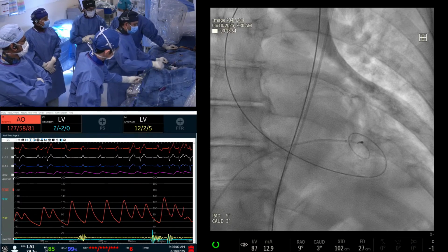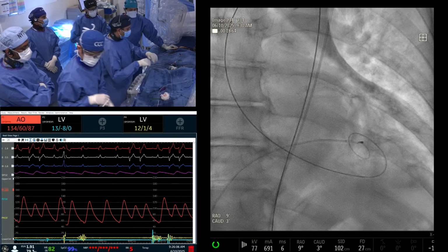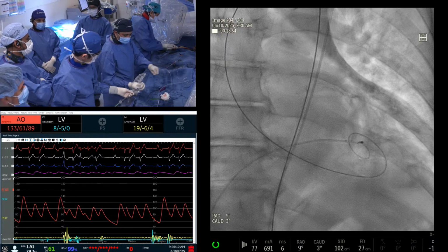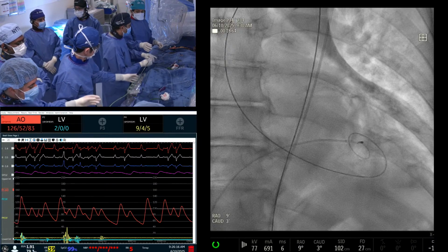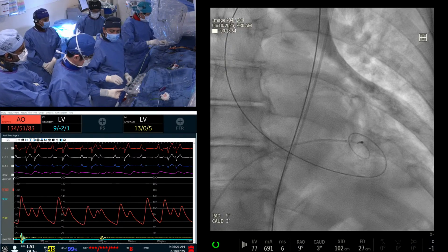Do you believe the post-dilation can cause degeneration earlier? That we don't know. No one has an idea, but it does improve the expansion. And we have a paper presenting at New York Valves coming up in a few weeks talking about this fluoroscopically, and we are in the process of submitting it for publication. So I believe in that.